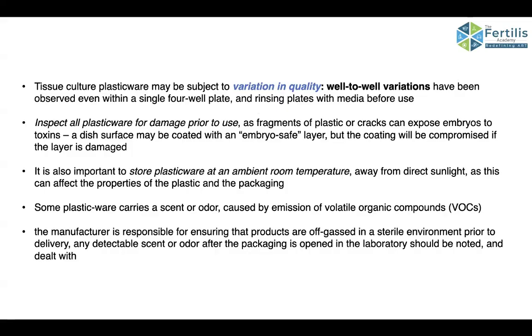Any damage, any fragment can expose the embryos to toxins, because there's a very thin embryo-safe coating on the dishes, and if there's a small crack, it will just break away this coating. So if the dish is cracked, especially where you're placing the embryos, this dish should never be used.